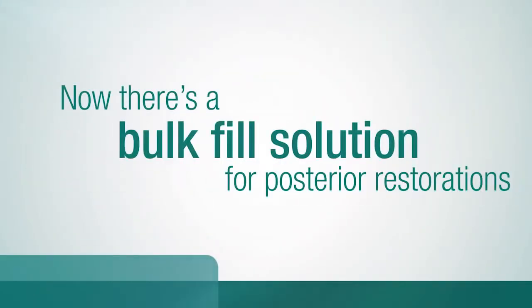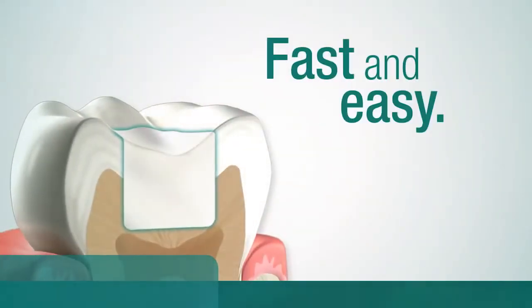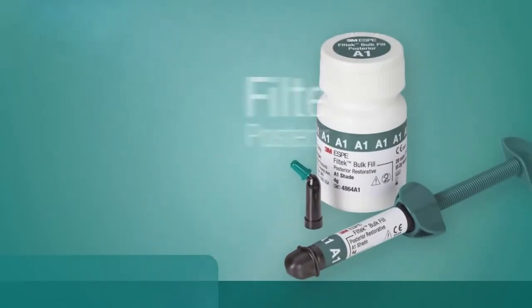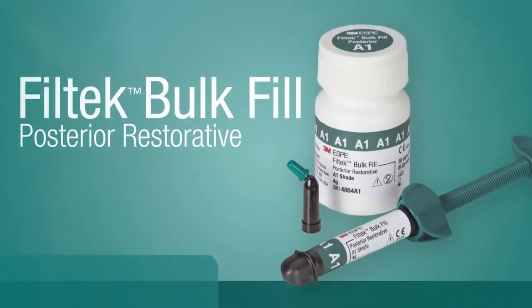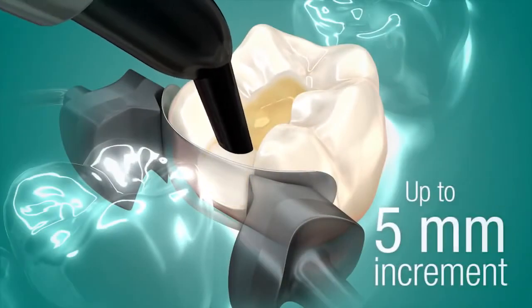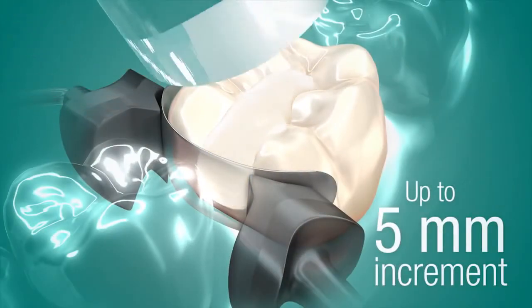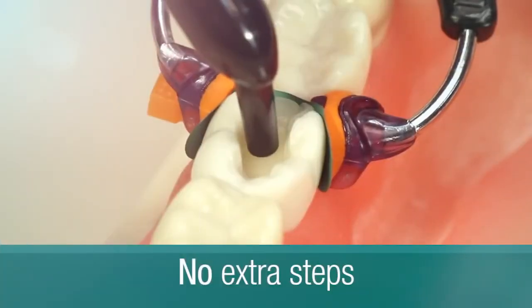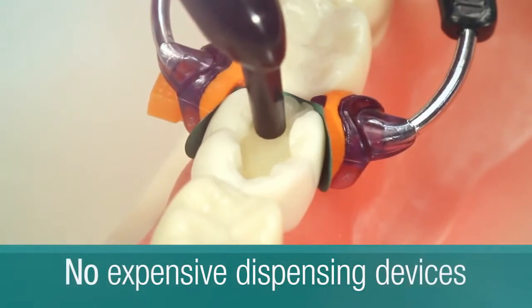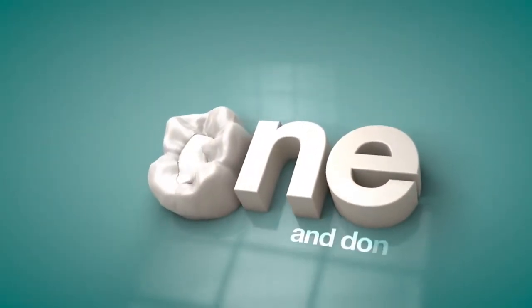Now there's a bulk fill solution for posterior restorations with excellent adaptation, and it's fast and easy: Fill-Tech Bulk Fill posterior restorative from 3M ESPE. The bulk fill that makes it possible to quickly place one increment up to five millimeters. After applying your adhesive, light cure and finish — no extra steps, no expensive dispensing devices.